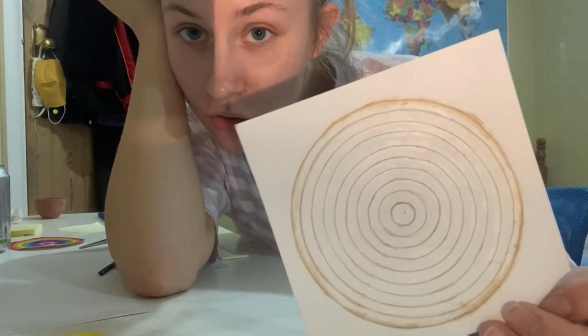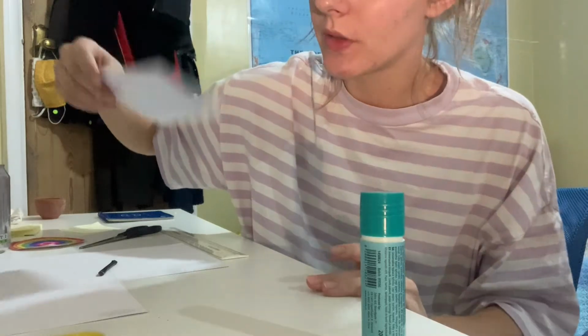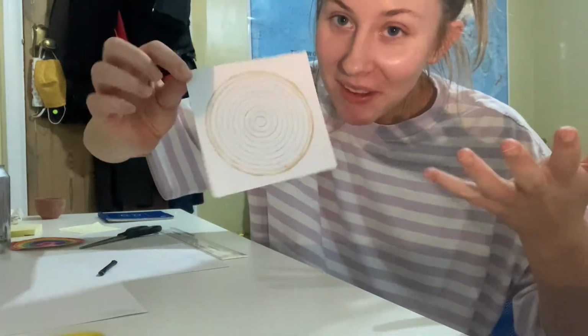But basically what I'm going to do now is go take a break, eat some food and let this dry. And then once it's dry, I'm going to colour it and let that dry for a little bit as well. And then I'm going to PVA it. So I'll be back when this is dry. And obviously that'll just be a second for you.